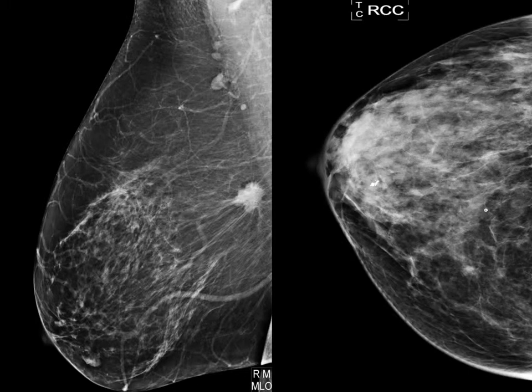When I was a student, most women found their own cancers. When a cancer is easy to feel, it is already too large. So, for the last 40 years, the basis of breast cancer control has been screening mammography. A mammogram can detect a breast cancer before it can be felt, and this, more than any other reason, is why breast cancer survival has improved so much since the 1970s.